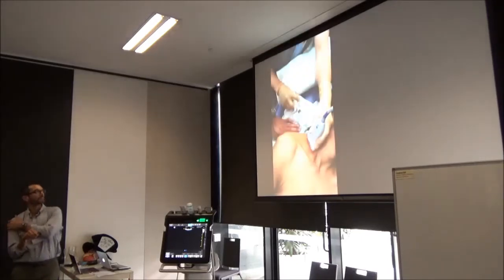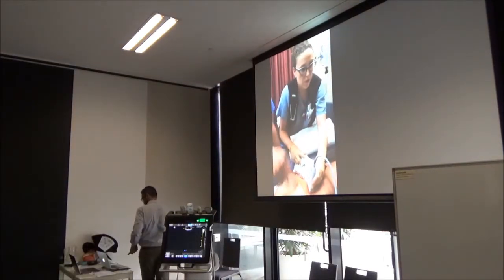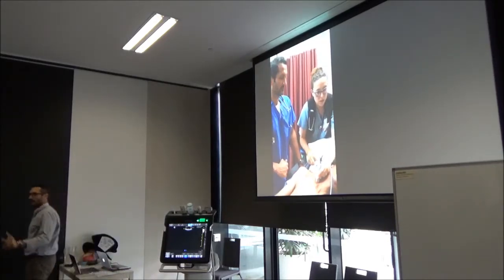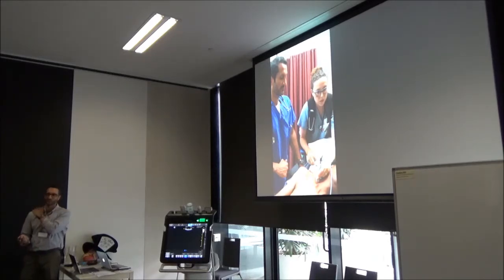Aaron, what sort of volume are you talking there? We put about 5 to 7 cc's. Yeah. Would it work for your proximal people? So, I classically, for him, you could theoretically, but I like to put a large volume because it hurts for such a long time. So I like to give a bigger dose. If I'm sending somebody home with a proximal humerus fracture, I'll put 10 cc's of bupivacaine in the shoulder, or whatever you like, and really give good anesthesia.